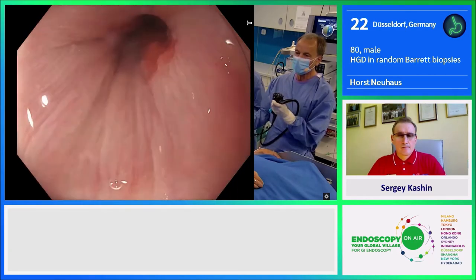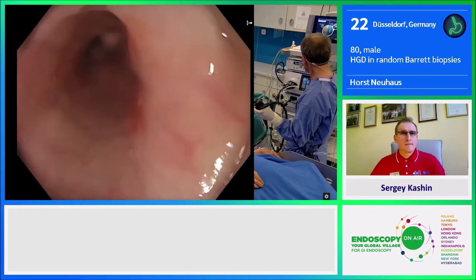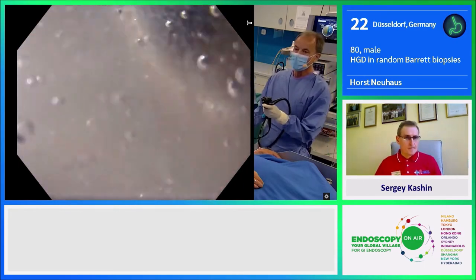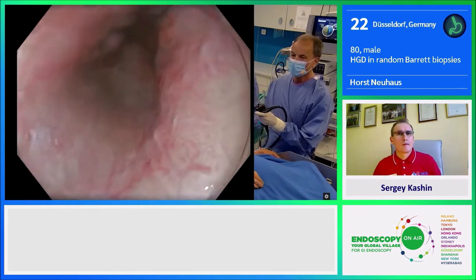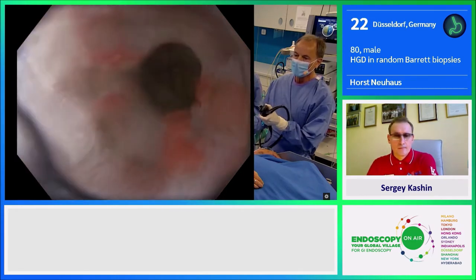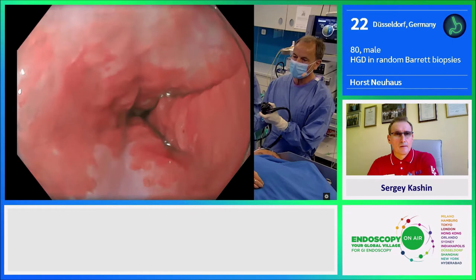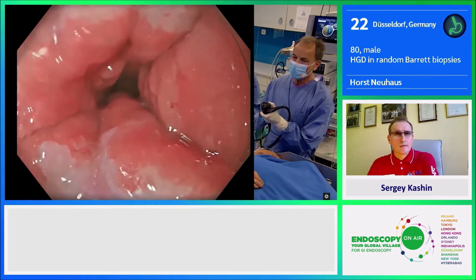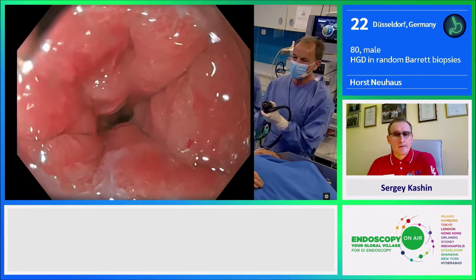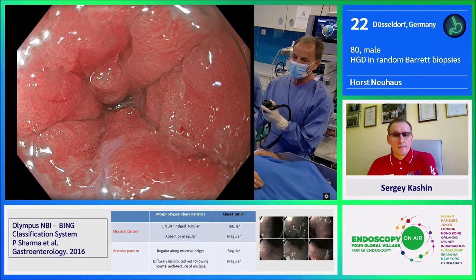The next step is using TXI — texture and color enhancement imaging. Pressing this button applies complex technology with a switch of the magnification, showing much better and more precise differences in color and brightness, with improved brightness and texture analysis. We can better see smaller changes in texture, as shown now — a fantastic resolution. I've already scanned the remaining mucosa between 6, 9, and 12 o'clock and did not see any additional focal lesion.